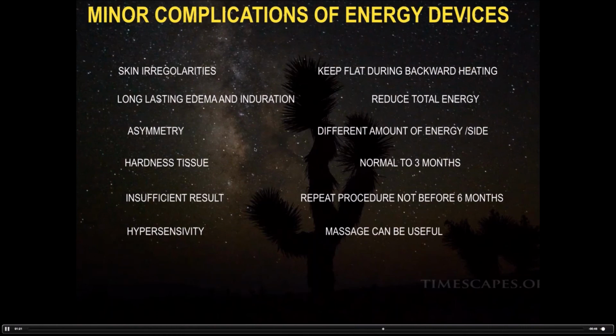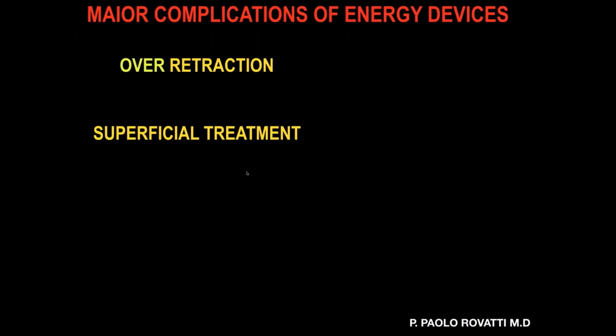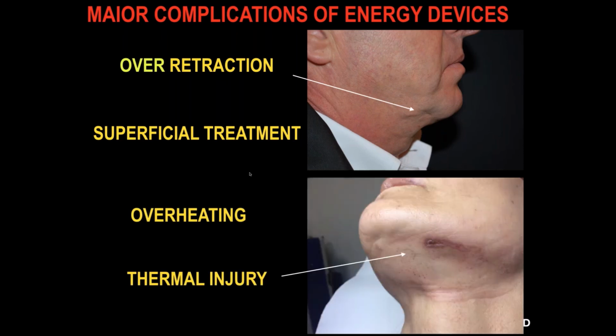But remember, if you were too superficial at first, sometimes they happen at the entry point, nearest where you have overheating, and sometimes at the end when you start, because you are too superficial. But I will show you after. These are major complications of the energy device. This is an over-retraction because this was too superficial a treatment, and this was a thermal injury because of overheating, too much fractional treatment, and too superficial at the entry point.